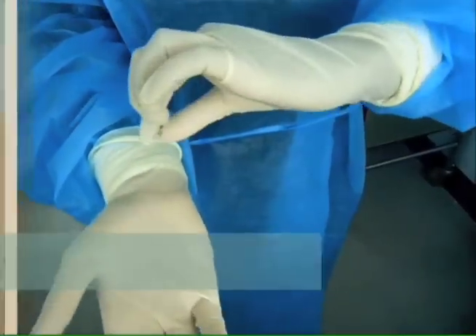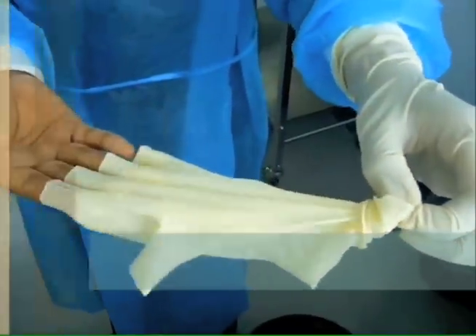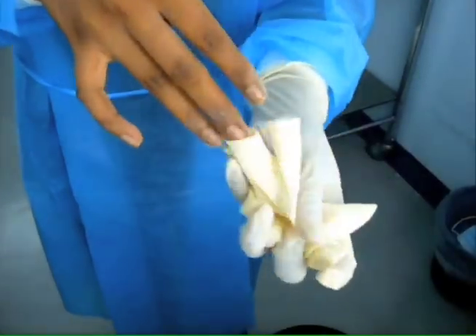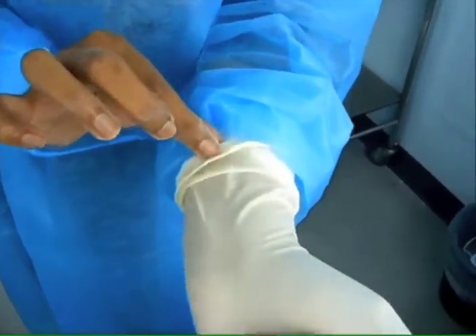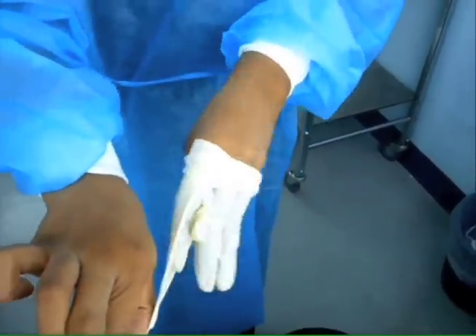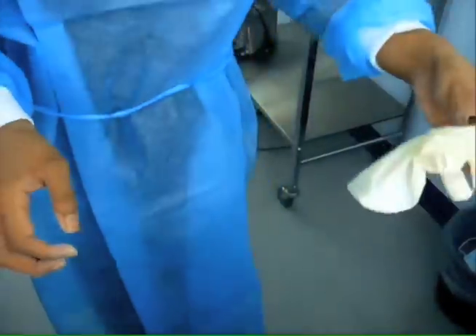To deglove, grasp the cuff of one of the gloves with the opposite hand. While holding the cuff of the glove, pull the glove off. Grasp the cuff of the other glove with the remaining hand and pull this glove off. Now both your hands are free from the gloves. Dispose the gloves into a clinical waste bin.